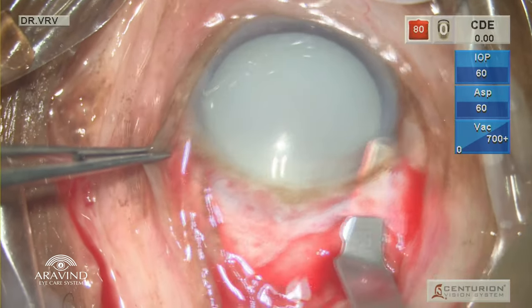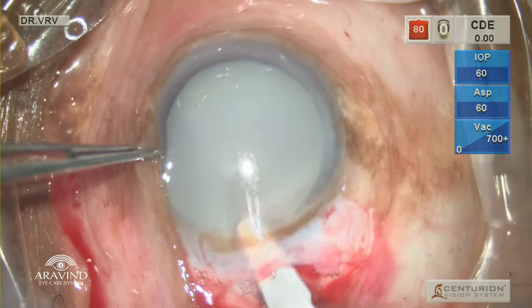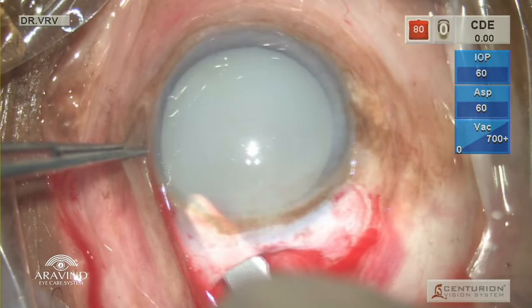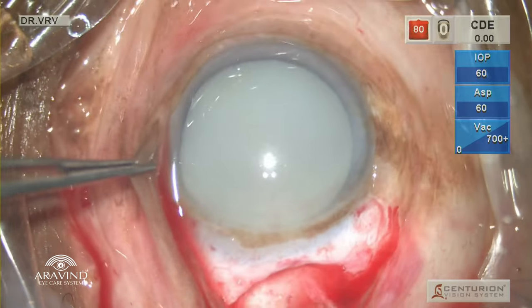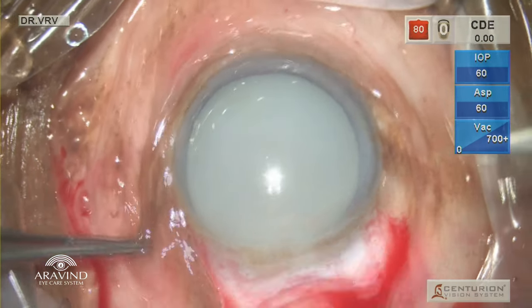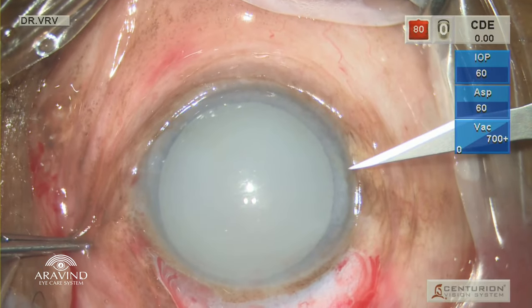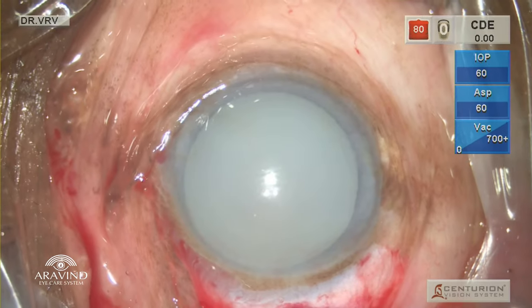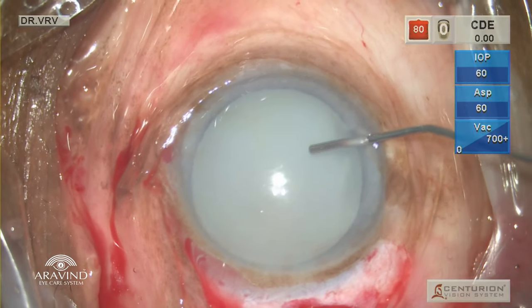You can see the crescent is already in the sclera. Once it reaches the limbus, with heel down and wriggling movement, the corneal plane is entered and it is swiped onto either side to create a uniform tunnel across. The 1.6 mm super blade paracentesis is made at the 9 o'clock position. The movement of the blade is parallel to the iris so as to have more stromal coverage.